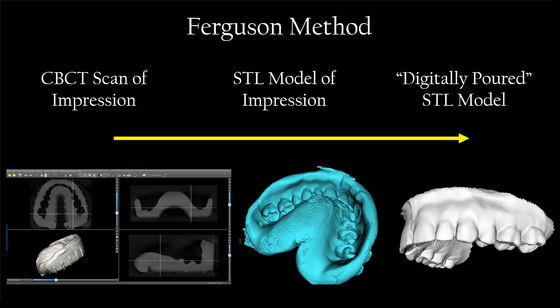This is the Ferguson method, developed by Dr. Rick Ferguson — it's a really sharp technique. What we start with is a cone beam scan of an impression. We'll open the DICOMs in the Blue Sky Bio planning software, digitize it, and turn it into an STL model of the impression. The unique thing is that we can then digitally pour that STL model and create basically the same thing you'd get if you poured an impression — a very accurate STL model you can use in the implant planning process.